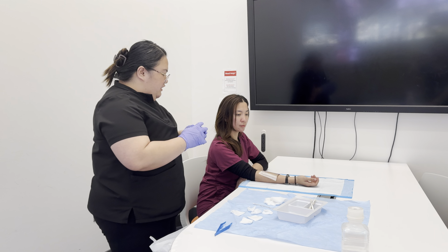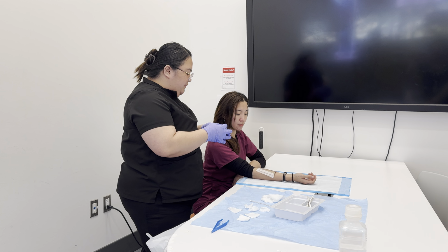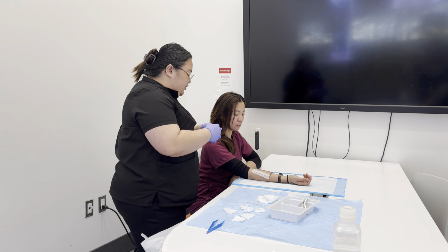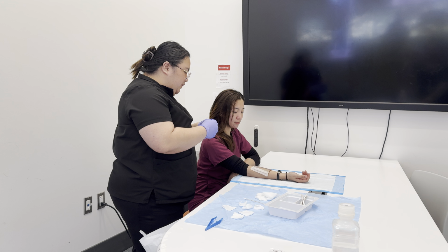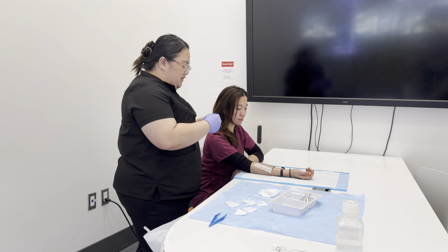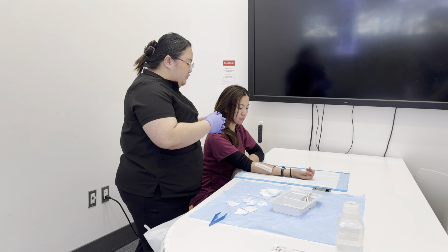The location of the incision is in the right anterior forearm. The suture used is staples, and it is complete. The edges are well approximated. There is no erythema and no swelling noted.